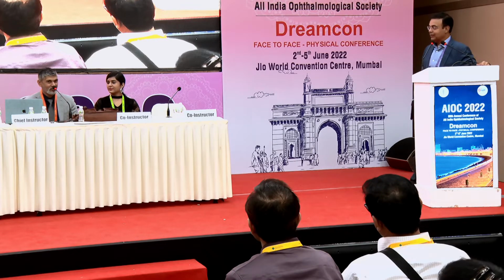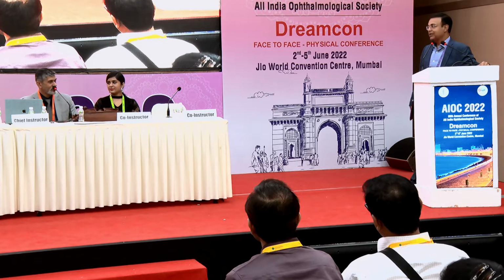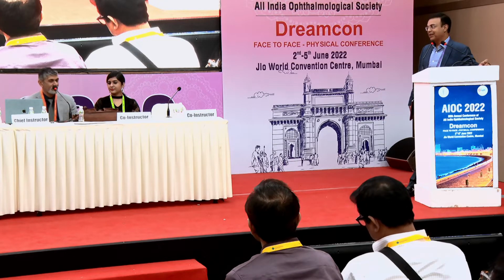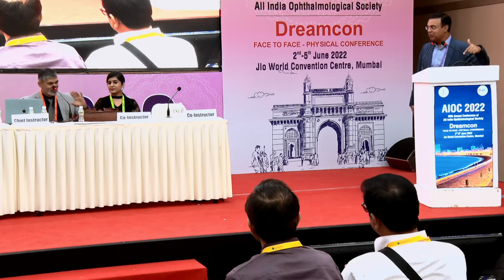What I like to do for post-RK cases now is to use ray tracing. Ray tracing, because yes, that accurately measures all the optical elements, and then by ray tracing you're able to, that's what I actually spoke about. Still I want to target about 1.5 diopters of myopia.